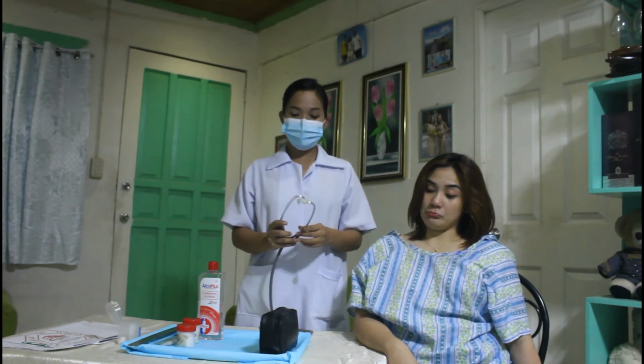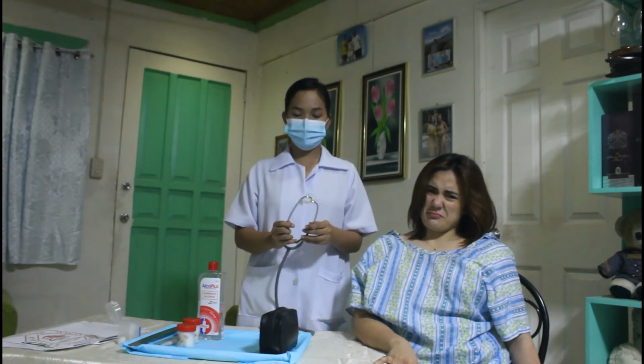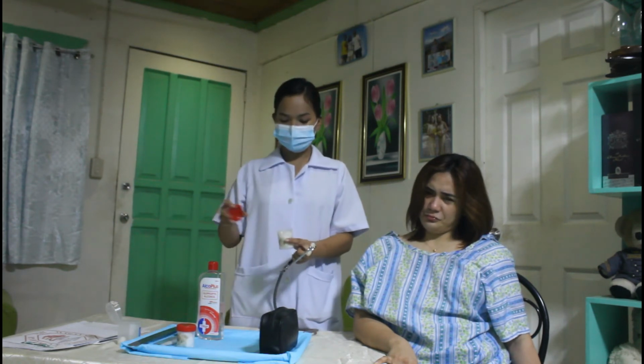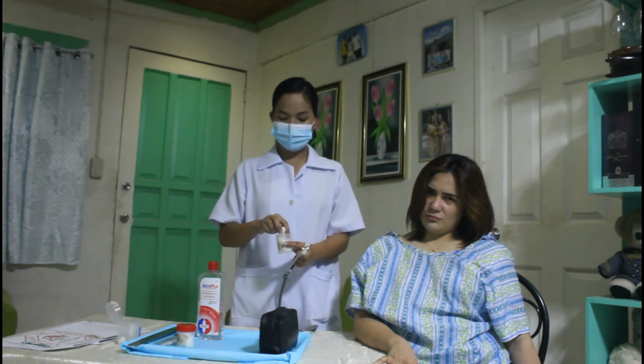So, again, we clean the earpiece and the diaphragm of this stethoscope with the use of cotton swab or alcohol swab.